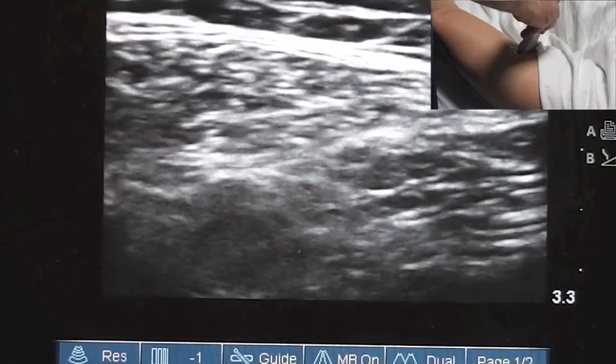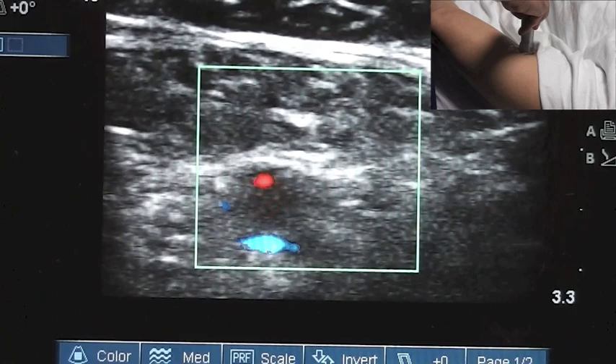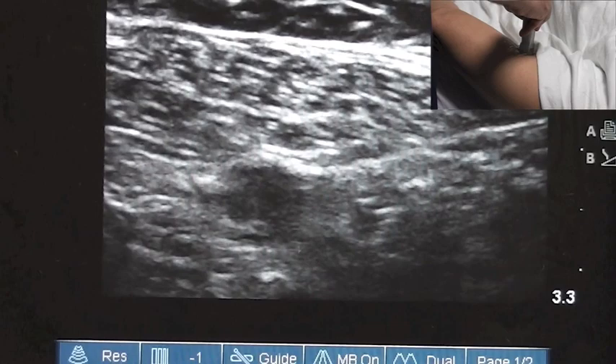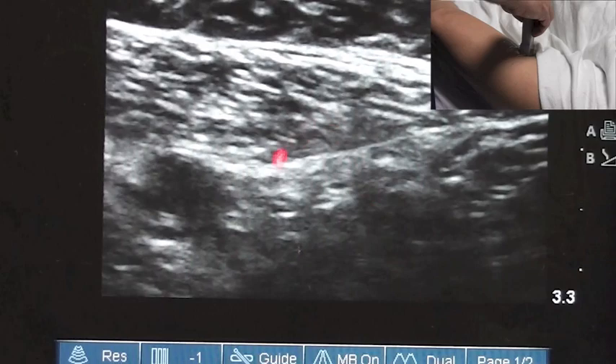As I'm scanning, I have now found my femoral vessels. As I turn my probe, these come into a better view. We can confirm that with color flow, which we see here. So we've now found our femoral artery and vein. That's a very useful landmark for this block, because we know that the saphenous nerve sits just adjacent to these vessels, just lateral to them.